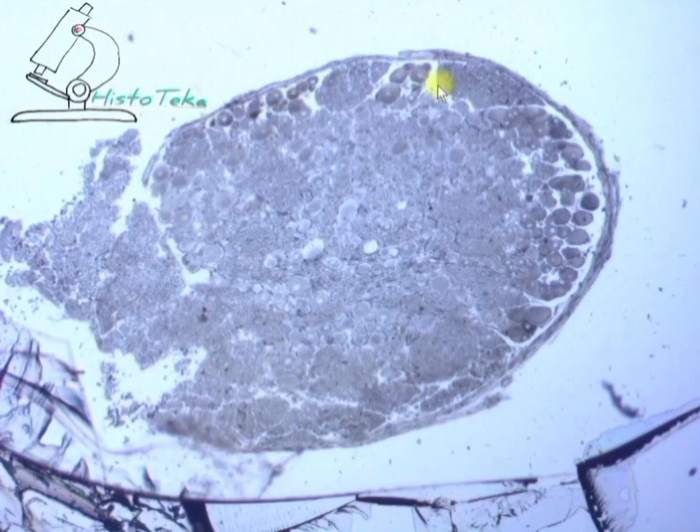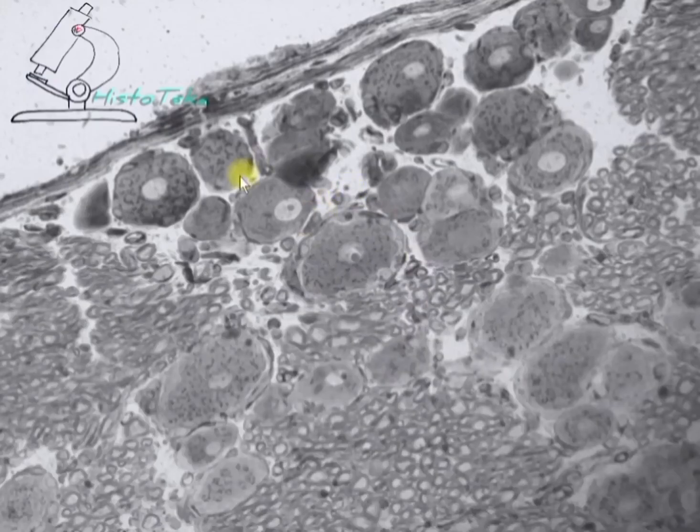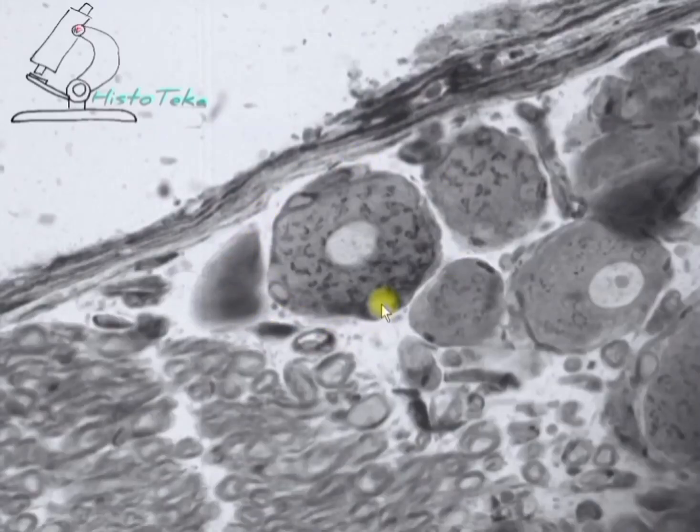Dictyosomes are indistinguishable at low magnification. The bodies of neurons, the nuclei, and now some dark short lines in the cytoplasm of neurons are clearly discernible. Let's move on to a high magnification. At high magnification, numerous curved or straight short lines and grains in the cytoplasm of neurons are clearly visible. These are dictyosomes.